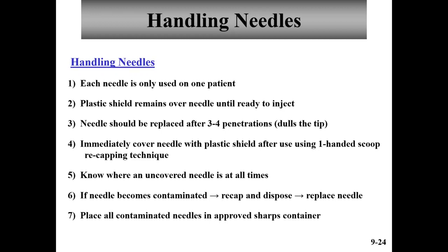It's pretty hard to believe I would have to say this, but I do because it did happen. A student was getting ready to inject a partner, and as she was going into the mouth, she accidentally stuck herself. That's a contaminated needle. At that point, she should have come out and replaced the needle. That's not an exposure for the student that was injecting because it was a clean needle.